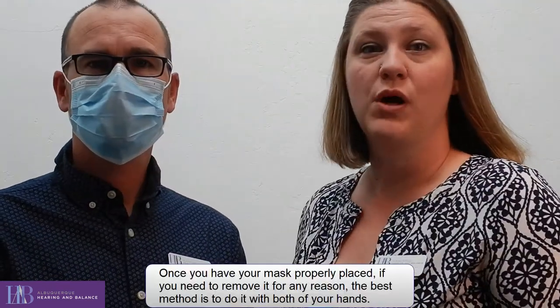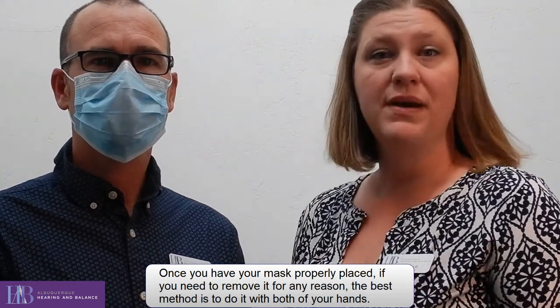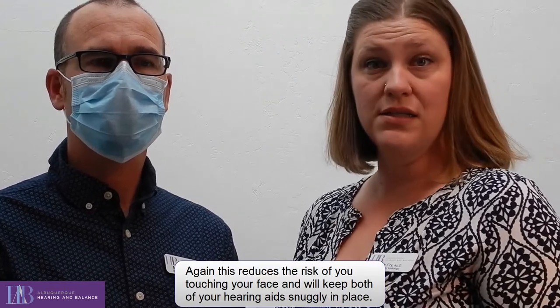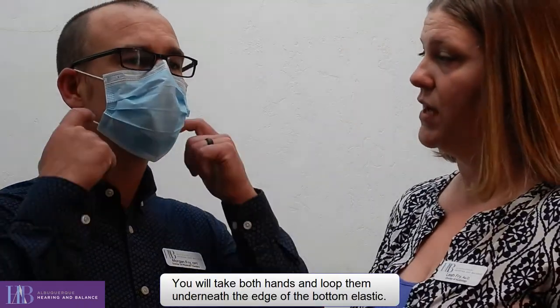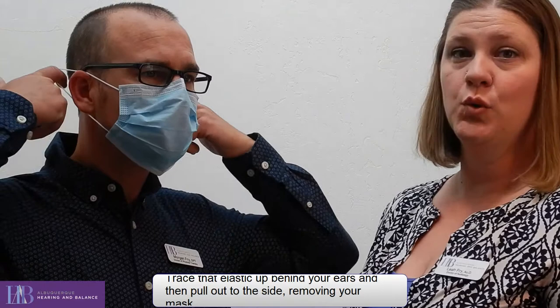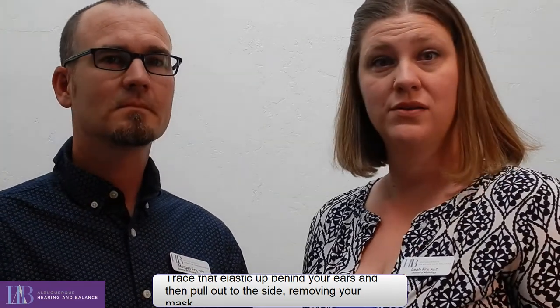Once you have your mask properly placed, if you need to remove it for any reason, the best method is to do it with both of your hands. Again, this reduces the risk of you touching your face and will keep both of your hearing aids snugly in place. You'll take both hands and loop them underneath the edge of the bottom elastic. Trace that elastic up behind your ears and then pull out to the side, removing your mask.